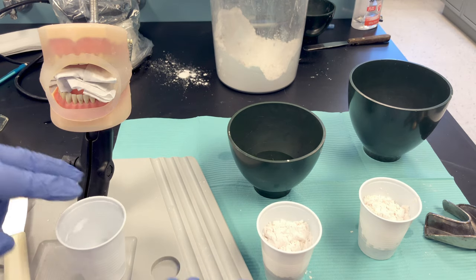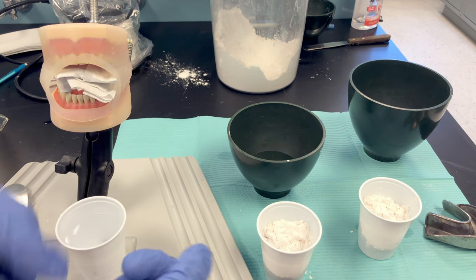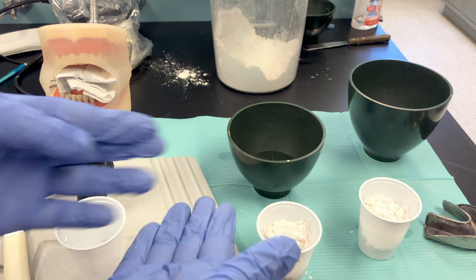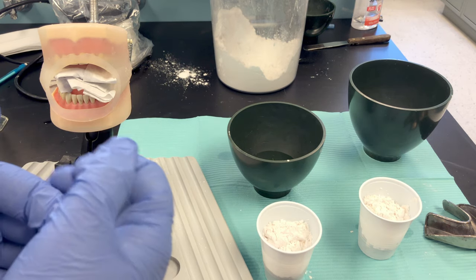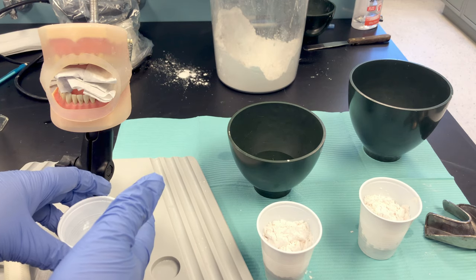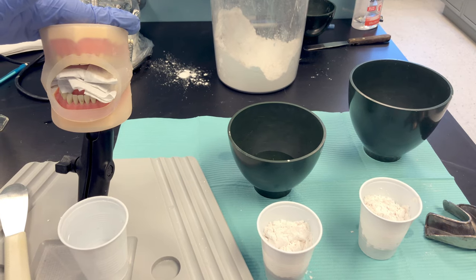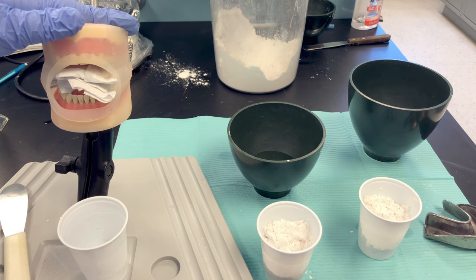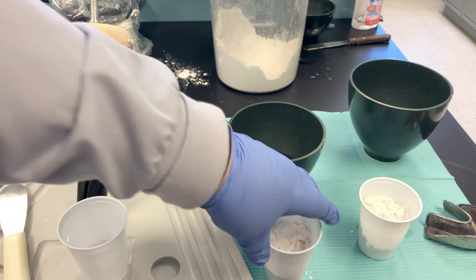After loading the tray, smooth the surface with water. When you take out the gauze, take some excess alginate material and wipe it on the occlusal surfaces — this reduces voids and gives better anatomy of the occlusal surface. Your patient's teeth should be clean; if you take an impression of dirty teeth, you'll take an impression of that debris. No plaque, no food particles — start with a clean mouth.